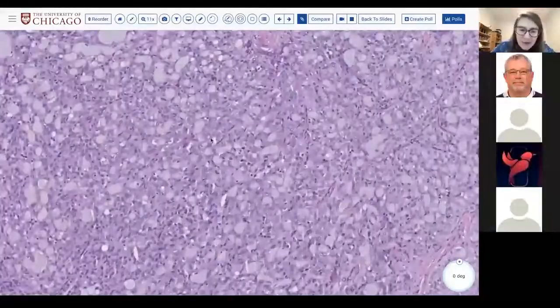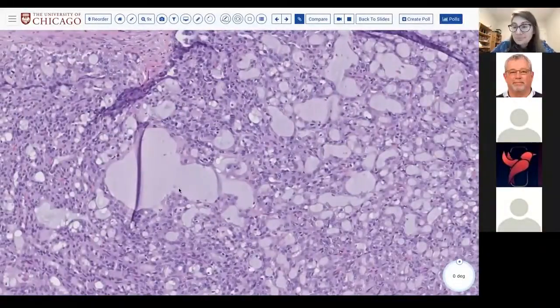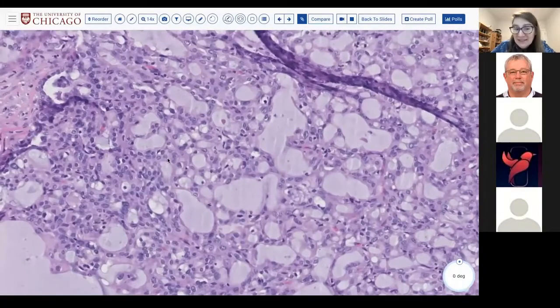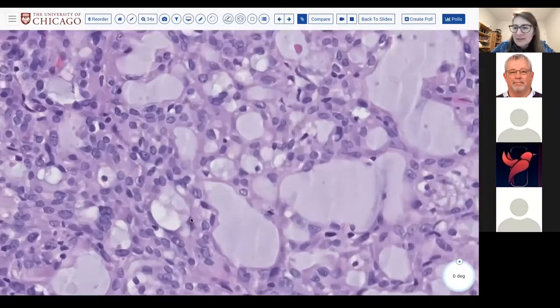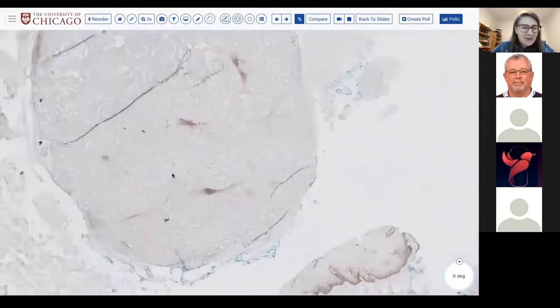Sort of similar to the prior, where we have these ductal or tubular-like structures, where we have this very watery secretory material, okay? We don't see obvious bilayered ducts. We do see ovoid, bland cells with maybe some small nuclei. Yeah, great. So secretory carcinoma, right? So let's just jump to our pattern, right?